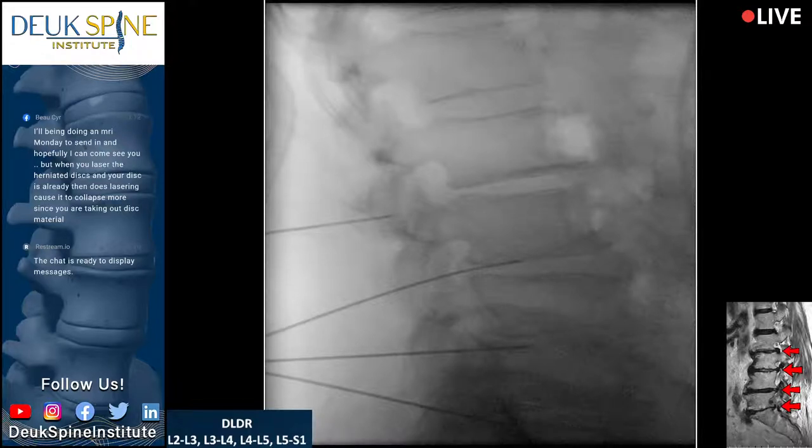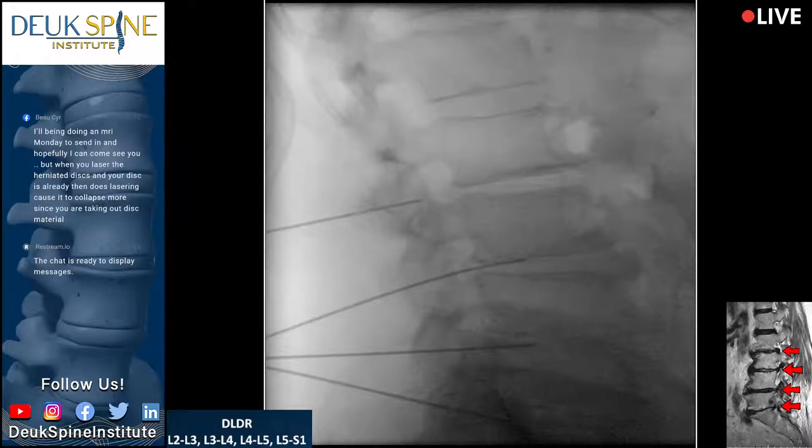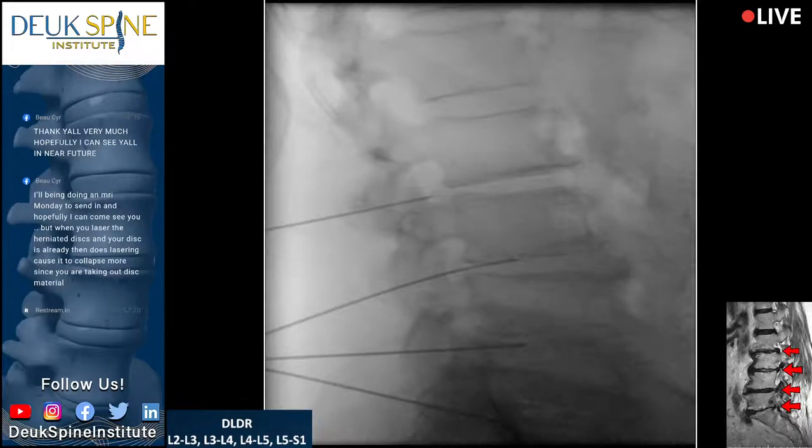Yeah, so that's better. Just about there. I can feel it. It wants to go. See, now we're touching the herniation. Can you show them how we're touching that herniation, and then we'll be done. Yeah, see the needle tip touching the herniation. All right, great. Great question, by the way, and I encourage you folks to ask questions.